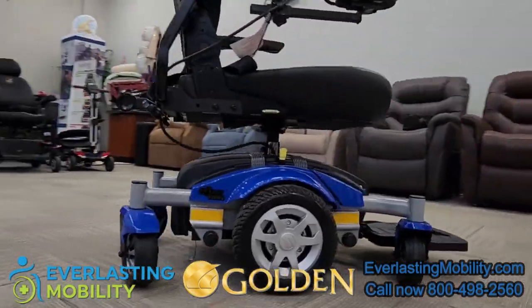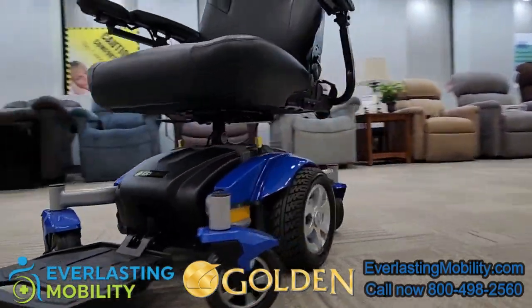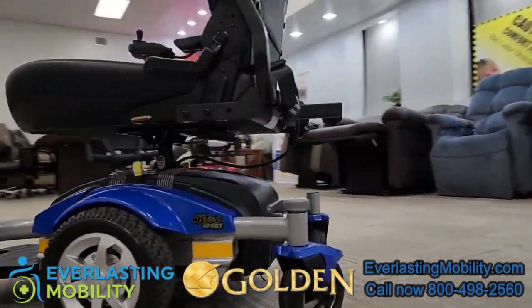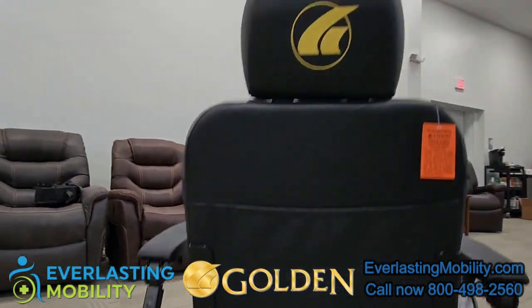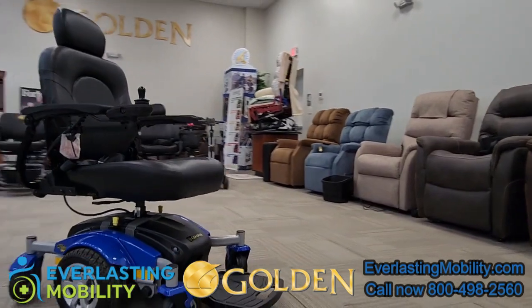Now this is not necessarily an easy-to-transport wheelchair, but you can remove the seat and fit it in the back of an SUV or a van — with the help of, we would recommend, two people to do that.